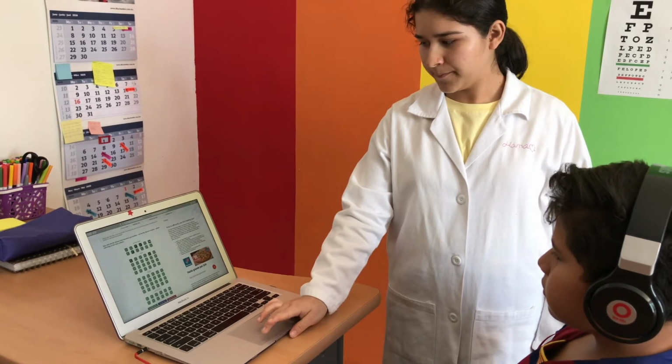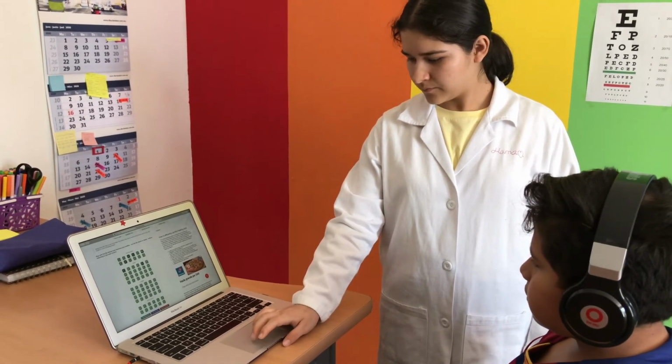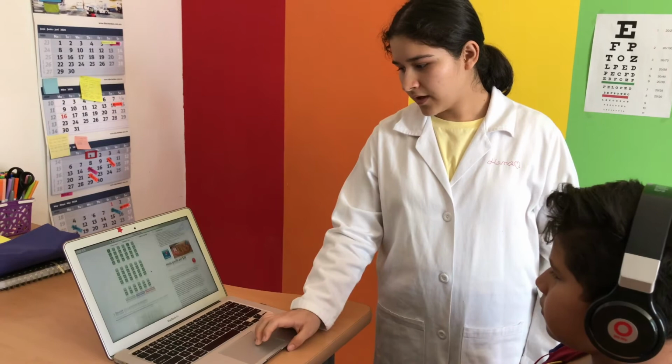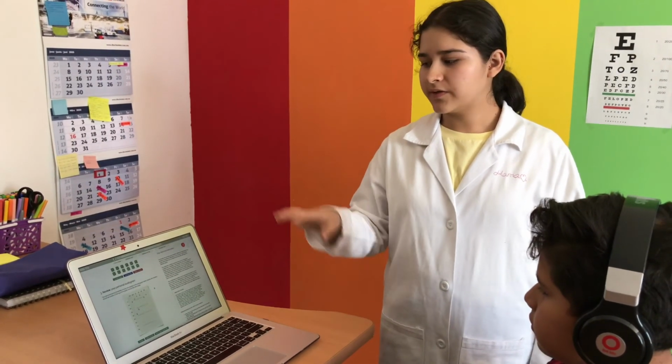Final one. Okay, so then we're just gonna submit the test, and that'll be all. This was a test for both ears. So that will be all, and we're gonna analyze the answers in a minute.